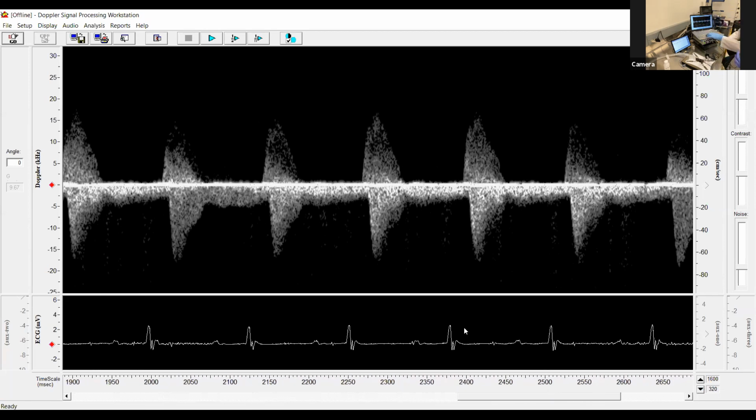So on the top probe she had on the aortic arch, we can see when it starts to come off the baseline. So that shows us when that pulse of blood hit that probe. It then traverses down the aorta and gets to the abdominal aorta, and it comes down through here. So basically we just need to measure that time interval, and then we have the caliper measurement from where those probes were located, and we can get the measurement of pulse wave velocity.